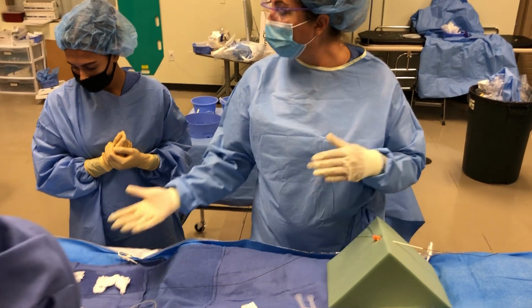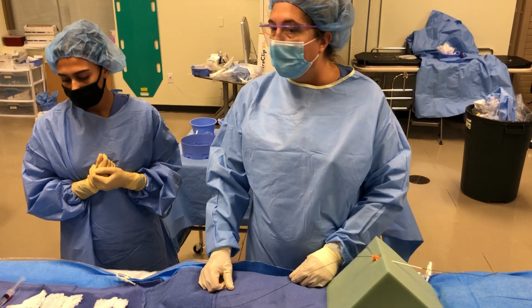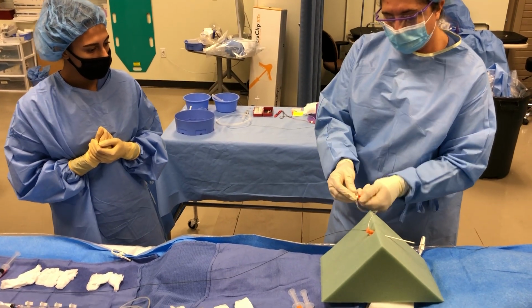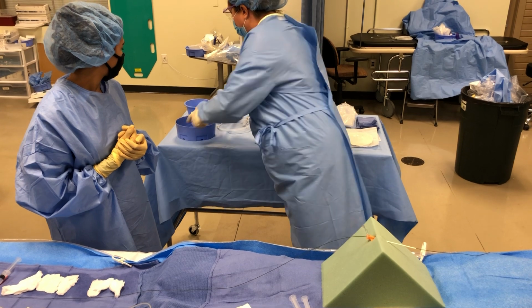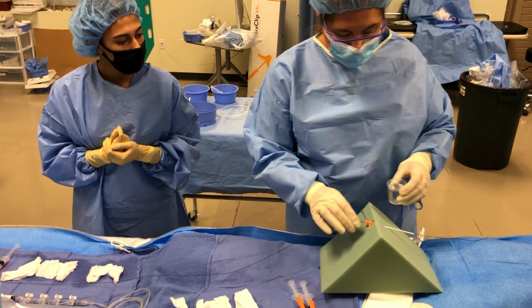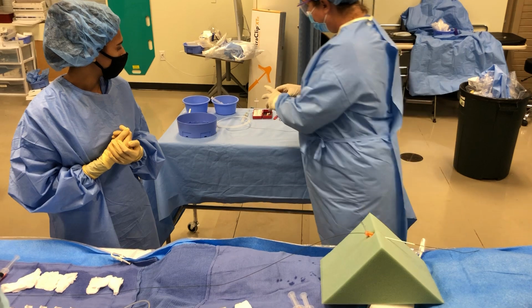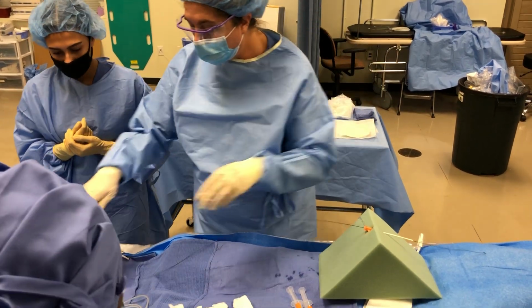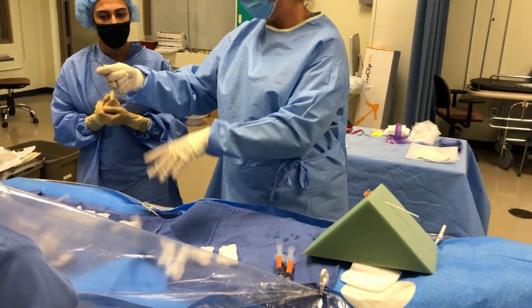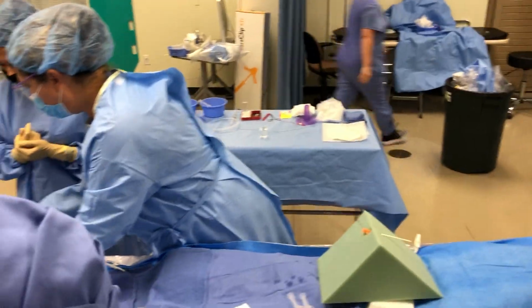And now it would be time to load the catheters on, which we'll go into next week. Flush, did you flush? I did not flush, thank you. Oh, and that sheath was not right, so it would have been bleeding all over me. So now, I am going to demonstrate flushing. I'm gonna go ahead and take this wire out real quick. The doctor is probably the one that's going to flush it. And this is how we wipe and wind. Okay. And then I might just tuck it under there.